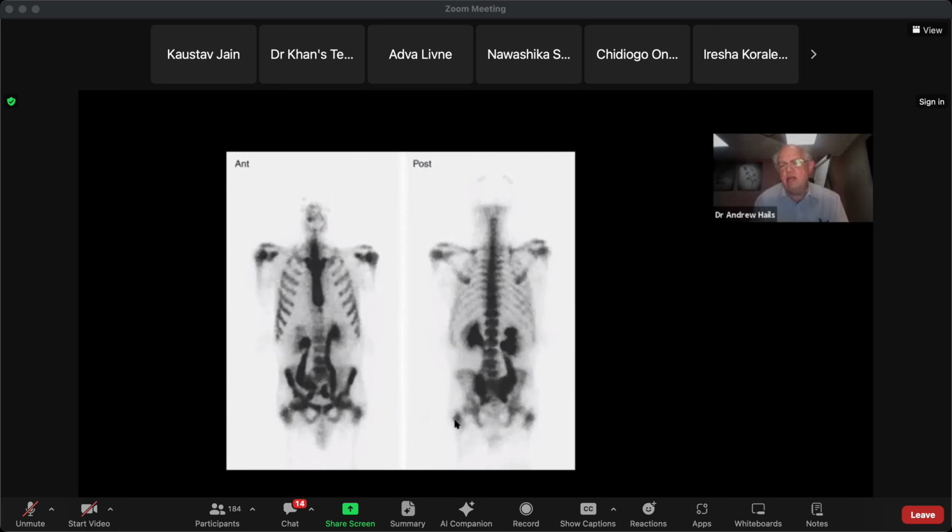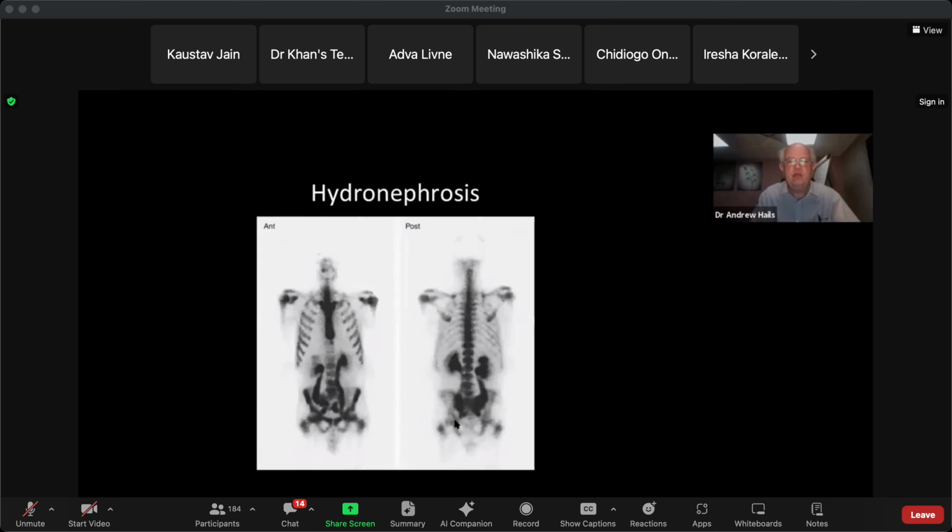Yes, that's right. Because this is just to show that on a bone scan, every now and again, not that unusually, people pick up problems with the renal tract. They pick up hydronephrosis, obstructive uropathy, which obviously they should have done the renal function and should have known, but they didn't know. So you have to be very careful in your report to mention this looks like an obstructive uropathy. I suggest maybe an ultrasound of the abdomen. I'll obviously check renal function as well. Maybe not just hydronephrosis.